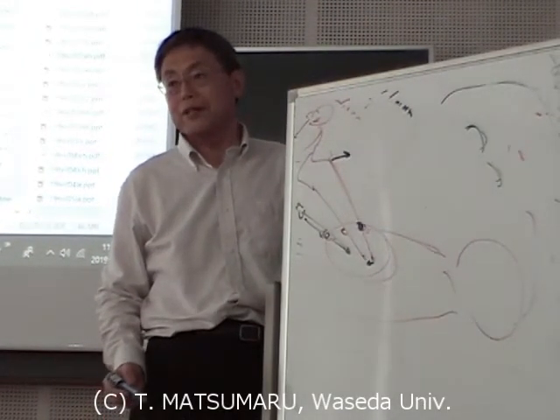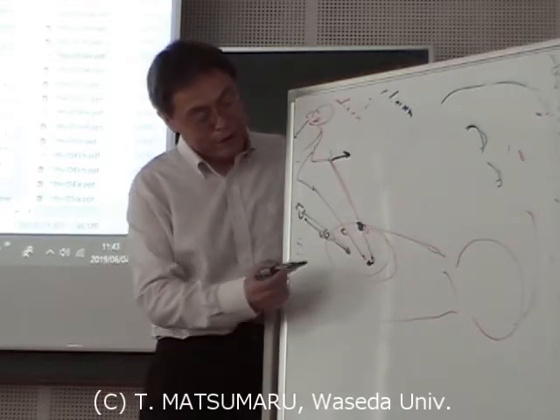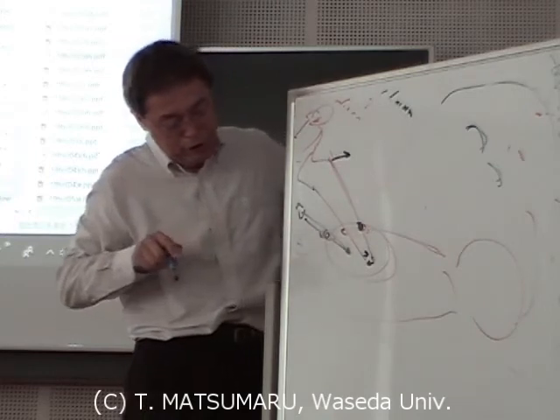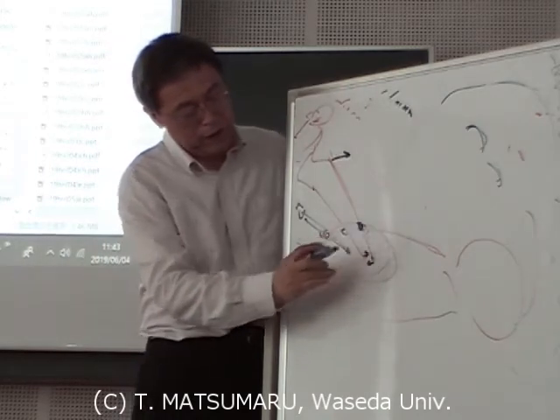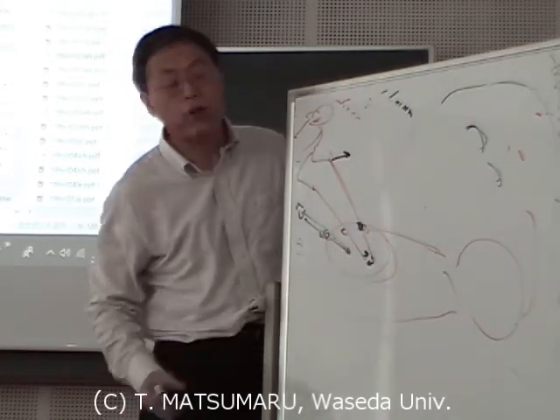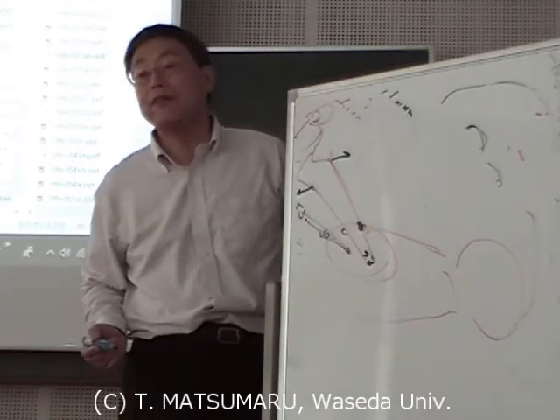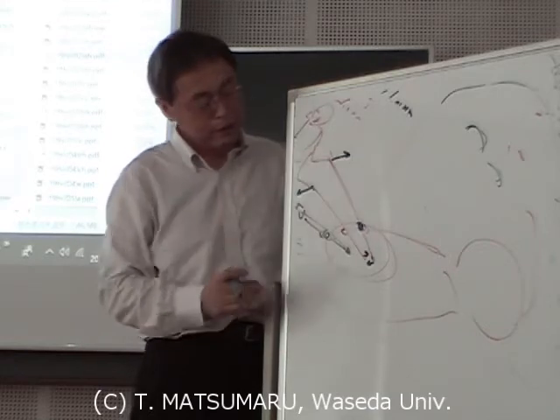Isn't that unpleasant? You don't want this. If the two forceps should be moved closer, the tool part should be released, should go forward.